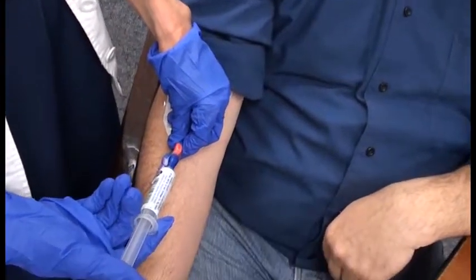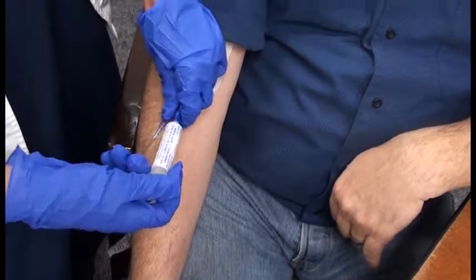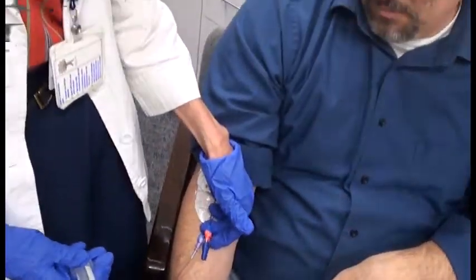All right, and so then you can flush your second flush. And make sure you unhook the last flush so that it drips saline, and then you're set to go.